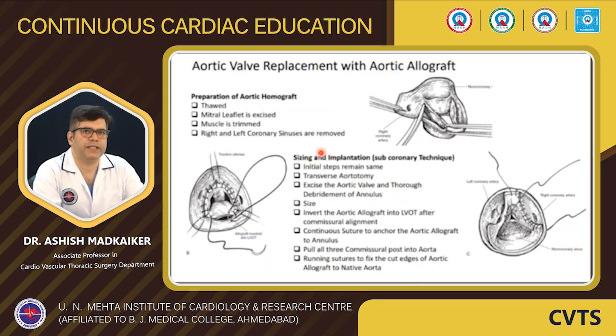Coming to aortic valve replacement using a homograft, it is important to understand that we can use a homograft to do either valve replacement or root replacement. In this particular session, we are discussing only AVR, so we will not discuss how we use a homograft or allograft to do a root replacement.